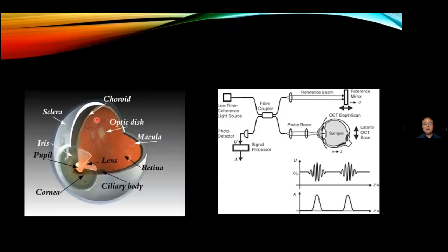Now, there's quite a big drive that the latest machines are making larger cube scans at the back, of which the nerve is also imaged at the same time. But that's how the machines are developing. There are still large areas like the ciliary body and vitreous base, and areas of the ora serrata and beyond the equator that we still cannot image with optical coherent tomography.